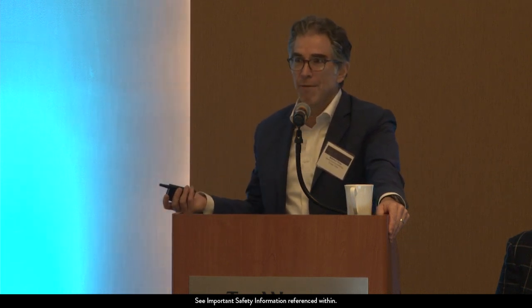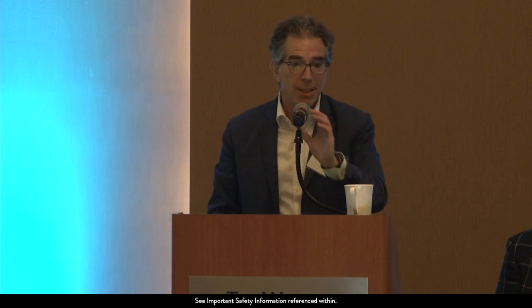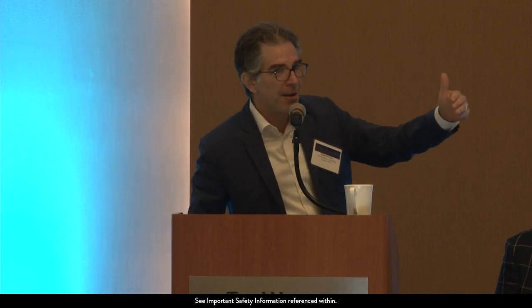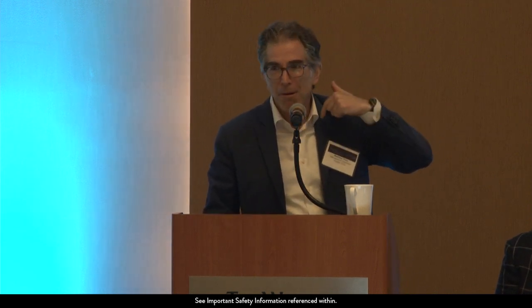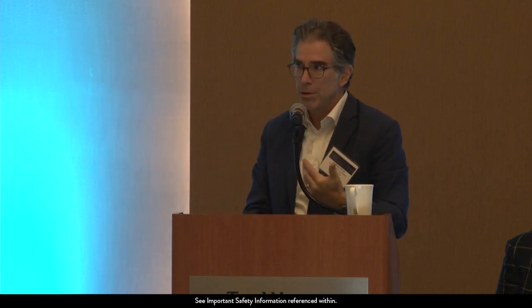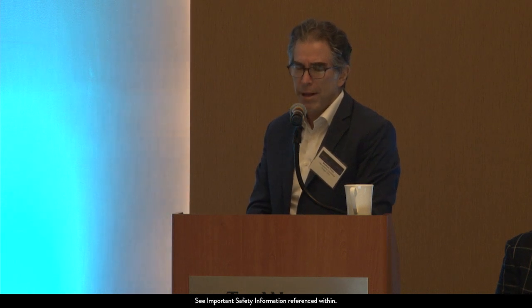But there are downsides for sure. And the more you do, the more that you see. It is an additional invasive procedure. I think a lot of patients, there's always a little bit of attrition in your patients, right? The more things that are needed, and you tell the patient, well, I got to put this thing down your throat before we do the procedure. It's kind of like, have you ever had an endoscopy? No, they haven't. They often will not want to come back to do that procedure. Certainly our patients are older, and often there can be complications.